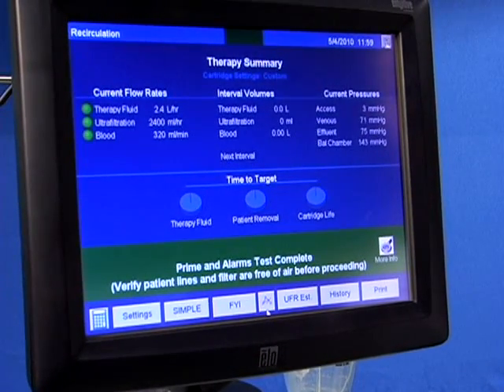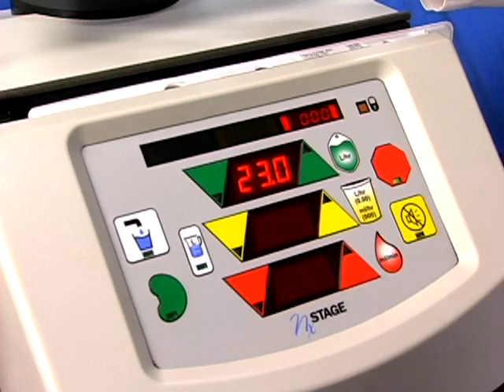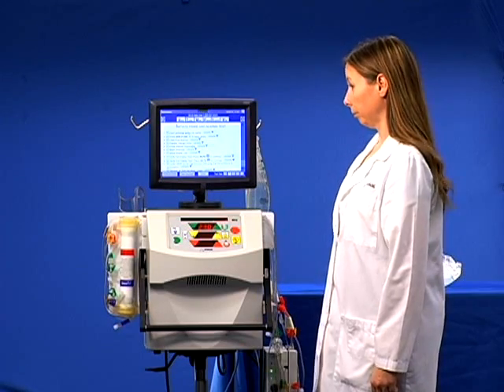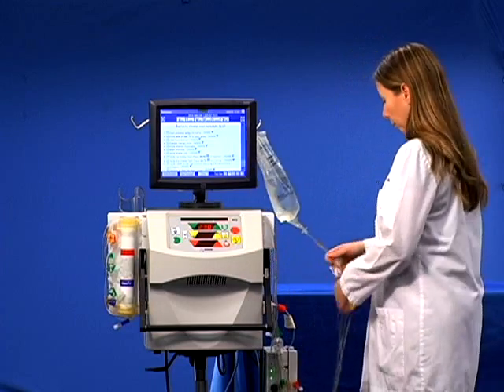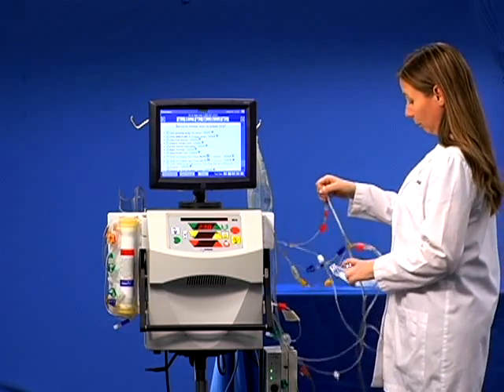You have not yet completed all the steps required before connecting the cartridge. Do not push stop. Do not clamp lines or make cartridge connections. Do not connect the patient to the device. Remove the air from the blood circuit by snapping the lines beginning at the priming spike.